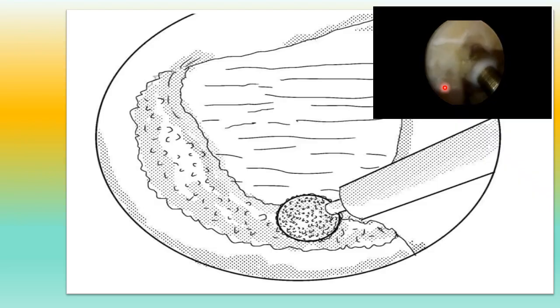This is the drilling of this part to create a wide working area also. That is the actual working area. Once bone is drilled, you get sufficient space and fluid chamber. Where you are working, this fluid chamber is enlarged. It is less obstructed by muscles and soft tissue, and your working area becomes clear. This is how we enlarge by drilling. Then, when the cut is thin, we remove it with the Kerrison.